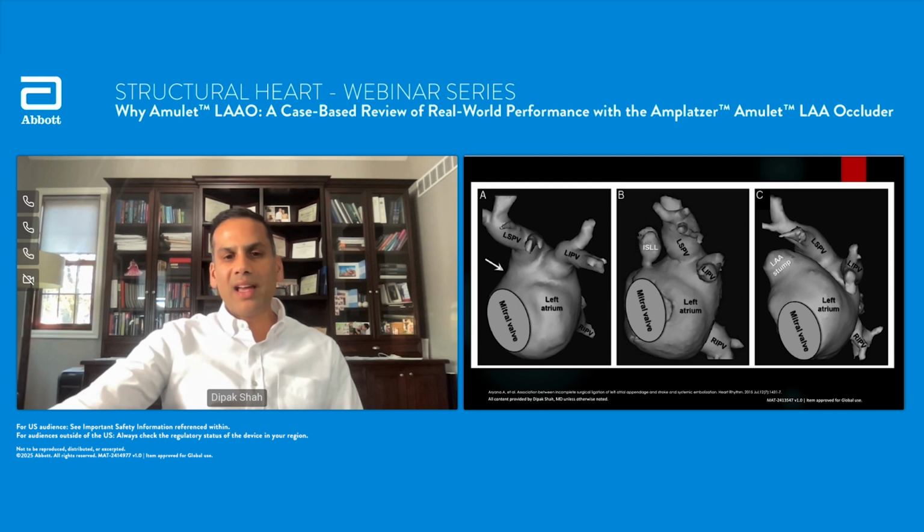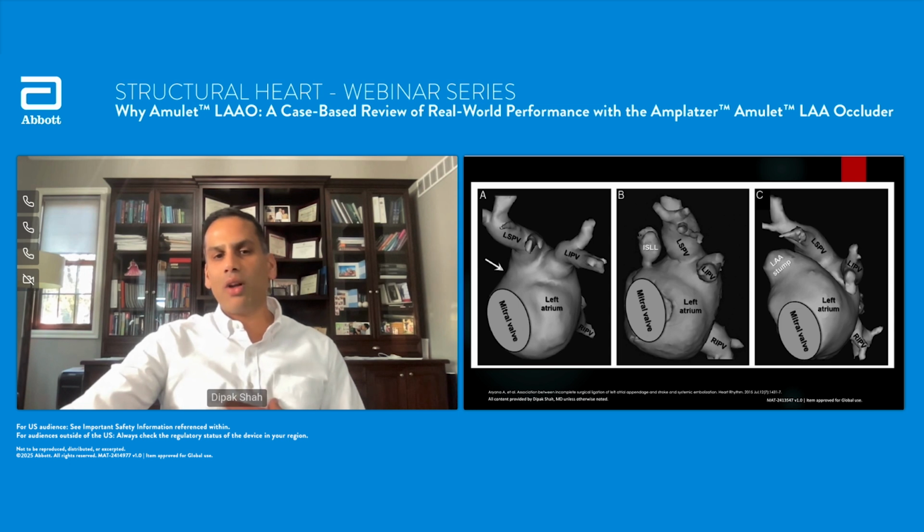And when you looked at this paper here, what they found, which was significant on multivariate analysis, was that panel B, which was incomplete surgical ligation, these patients had a 24% risk of CVA or systemic embolism compared to the other morphologies. And again, this narrow neck and all of these things are a big issue. We see this all the time. You know, the surgeon after mitral surgery or all of this stuff does their technique. And if you find out later on with TE or some sort of imaging, you're sort of seeing this.